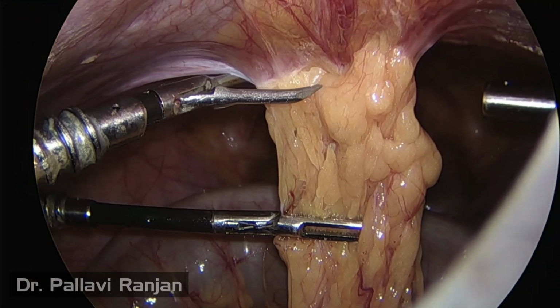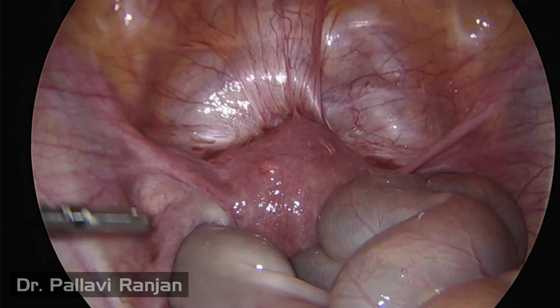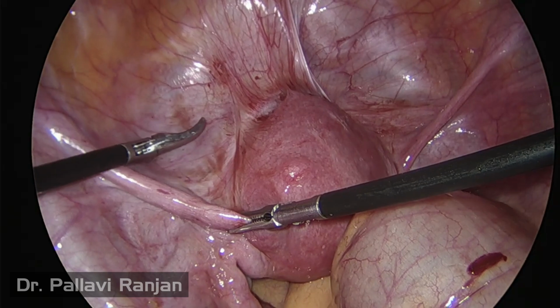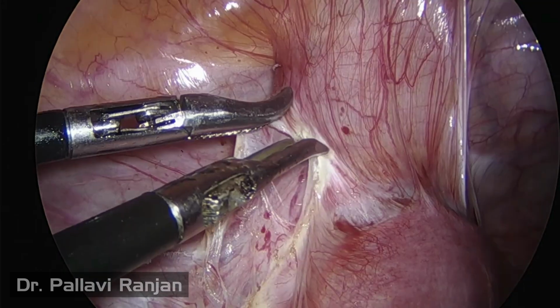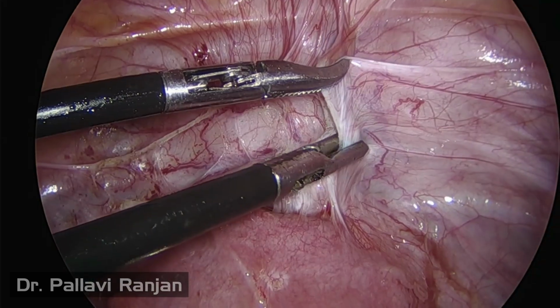So we are proceeding here with the surgery with omental dissection and adhesiolysis, and now we are going ahead with the bladder dissection. Since she is a case of previous caesarean section, we are doing a central bladder dissection. In normally previous caesarean cases where we are not doing a conservative surgery, we go ahead with the lateral window technique. But since this is a conservative procedure, we are going ahead with the central bladder dissection.